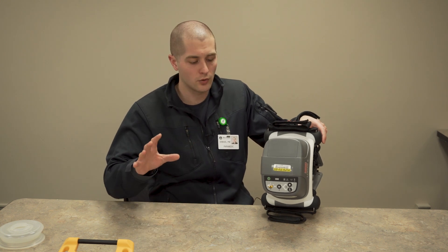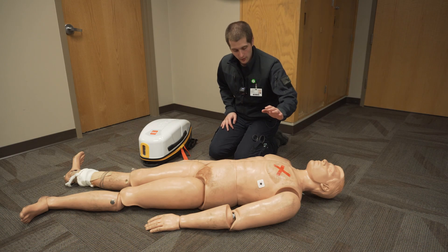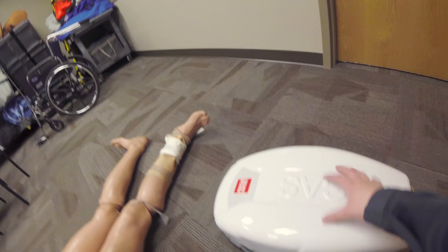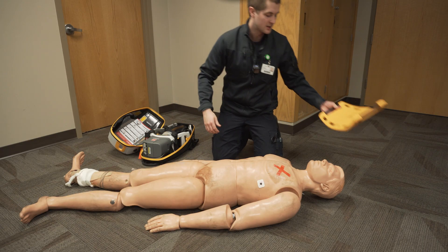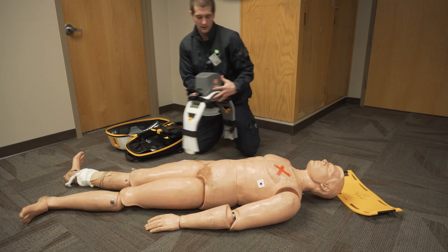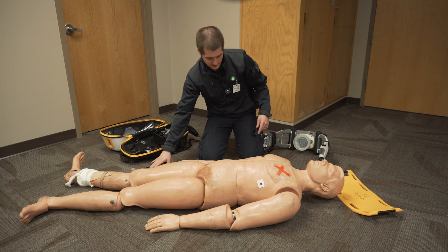Let's go over applying this to a simulated patient so you get an idea of how it actually works. When you first get on scene, direct your partner to start manual compressions, which should not be interrupted for more than 10 seconds throughout this entire process per AHA guidelines. Come over to your Lucas, open it up by pulling the two tabs and opening it away from you. In the lid, you'll have your back plate — pull that out and set it at the patient's head so you know where it is. Next, take your Lucas 3 device out, power it on — it's going to do a quick self-check — and remove the head strap from the case.